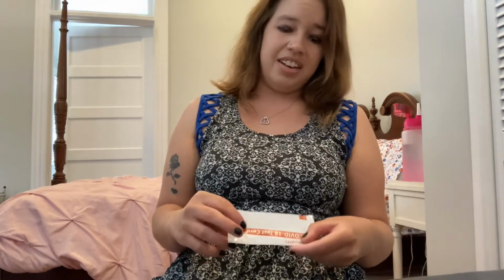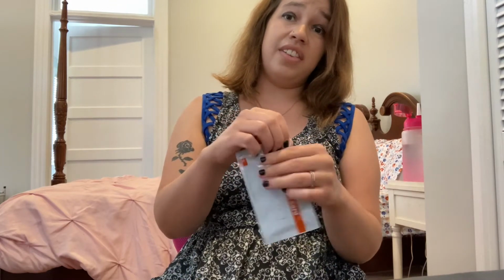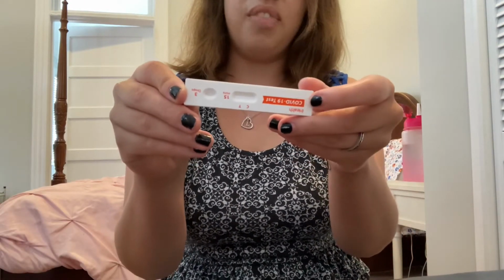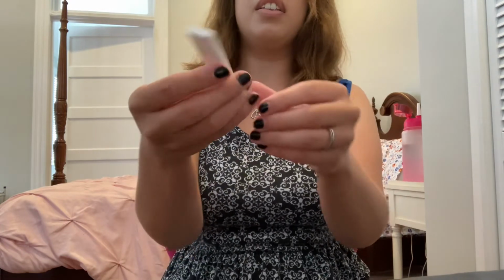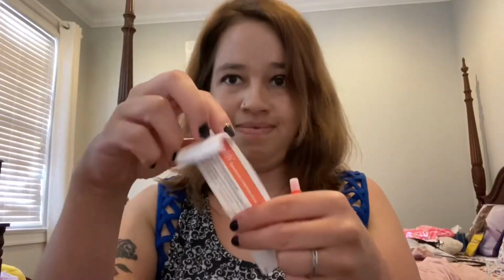For those of you who have never taken any of these at home before, I could show you how it works. Well, I kind of already told you, but I thought maybe you'd like to see how it works. Like I said, it looks almost just like a pregnancy test, but I promise it's not, as you already saw in this video. It also comes with this Q-tip that you put in your nose, and after that you put it in this liquid and drop it into the test.